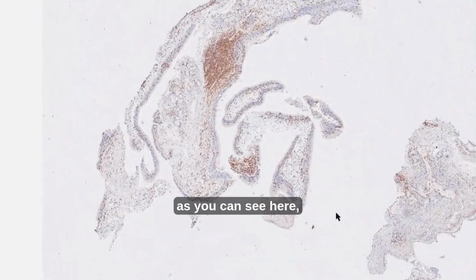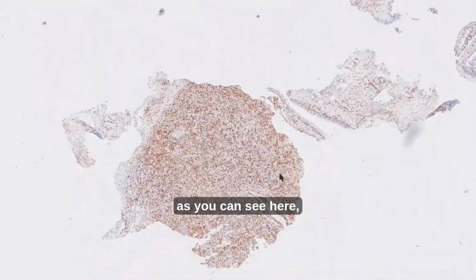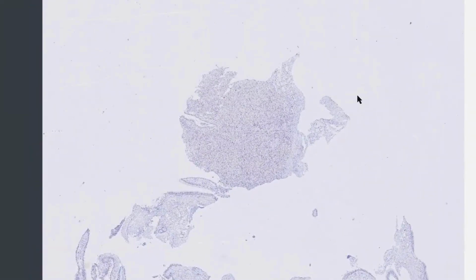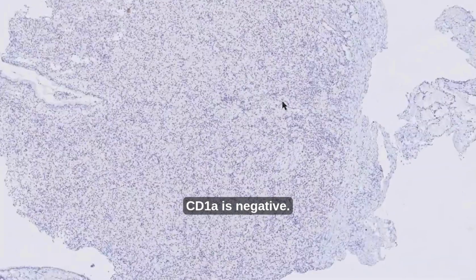CD3, as you can see here, is prominent, but is not expressed in the neoplastic cells or cells of interest. CD1a is negative.